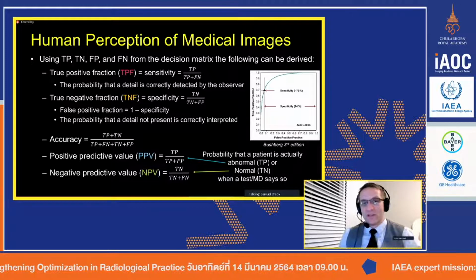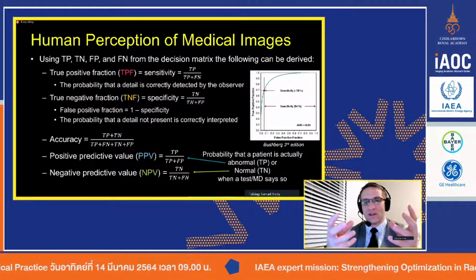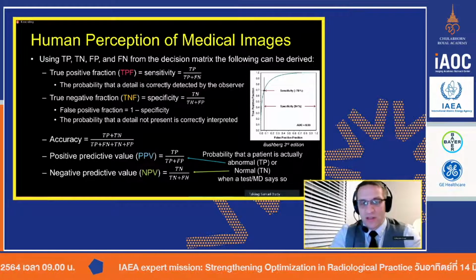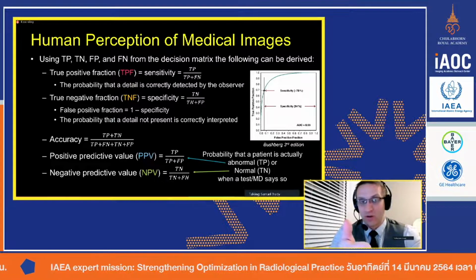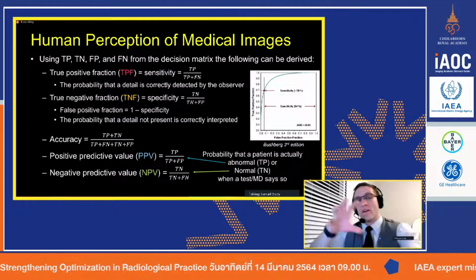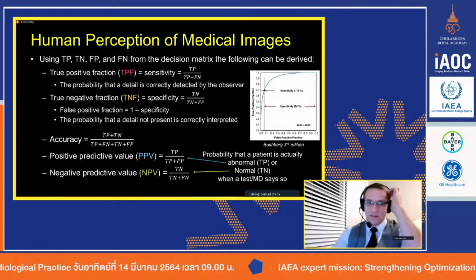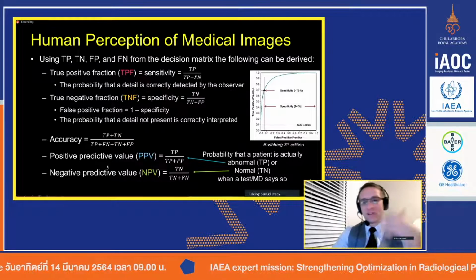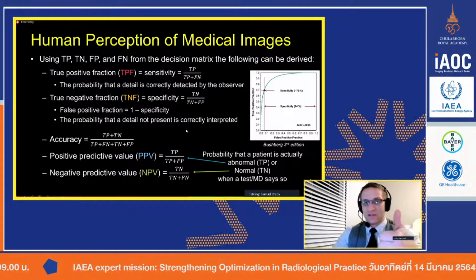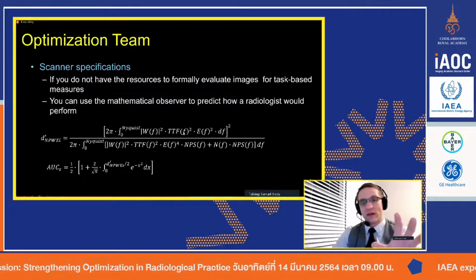If you have the ability, after you've gone through and made some image quality assessments and made a protocol or technique change, now you want to make sure that A, it's better, or B, at the least, it's not worse. And so if you have the ability, you acquire maybe a week, 2-3 weeks' worth of data, and then you do one of these calculations where you can look at the positive predictive value, the accuracy, etc. Now, not everyone has the expertise to do this, or the time to do this. So I presented this option to you that first week.